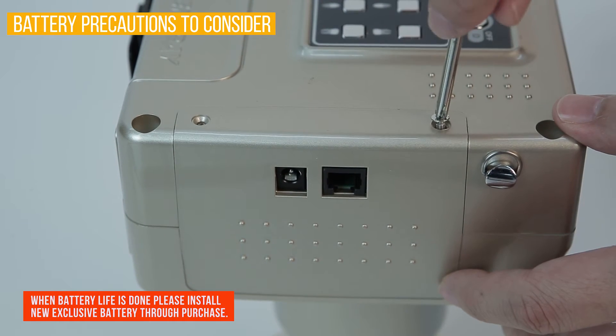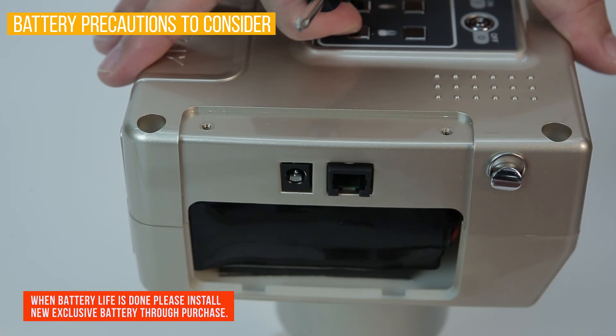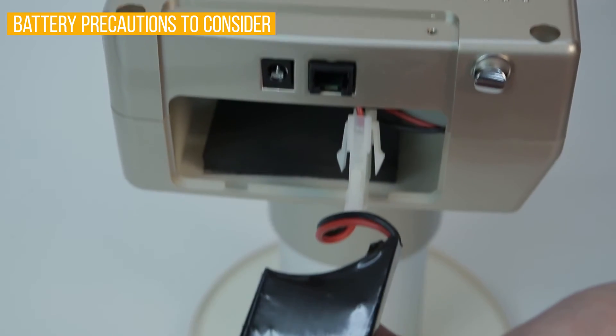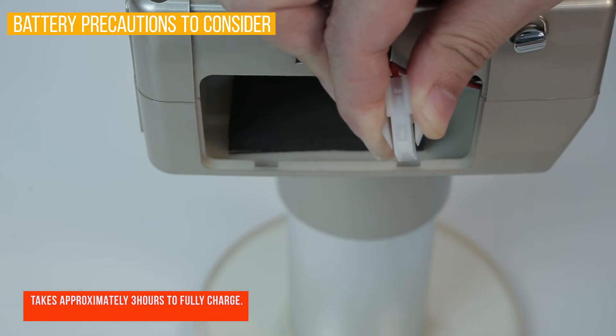When changing batteries, please follow these directions. When 'battery low, please charge' is shown on screen, please charge by using the charger.